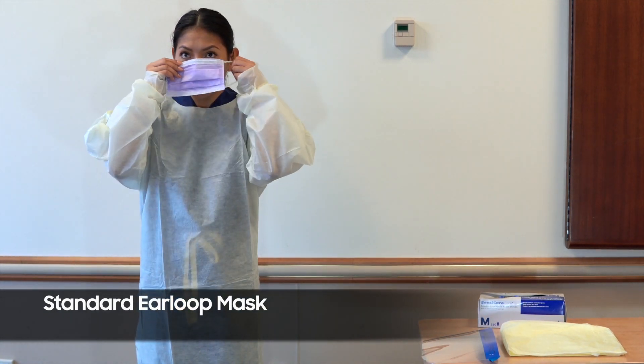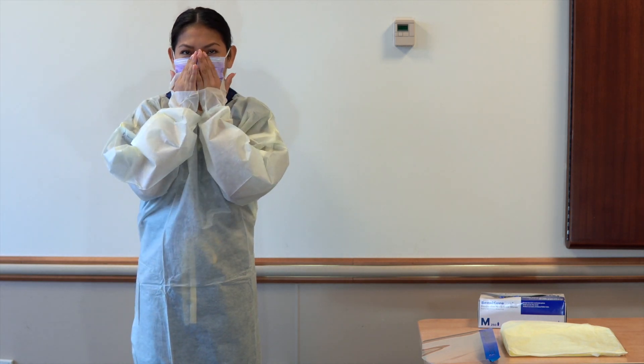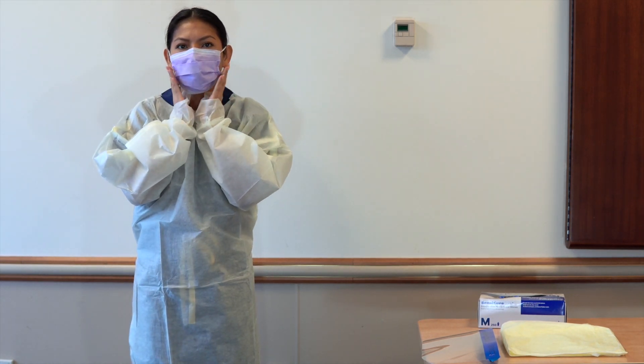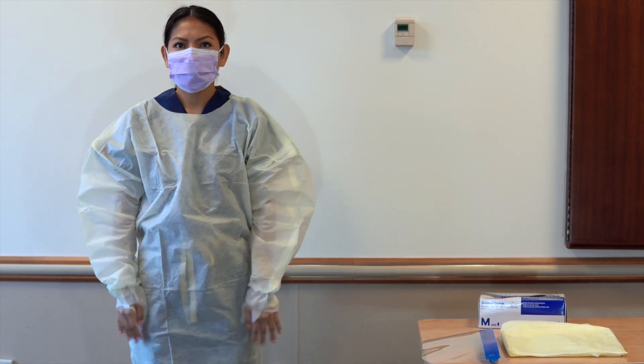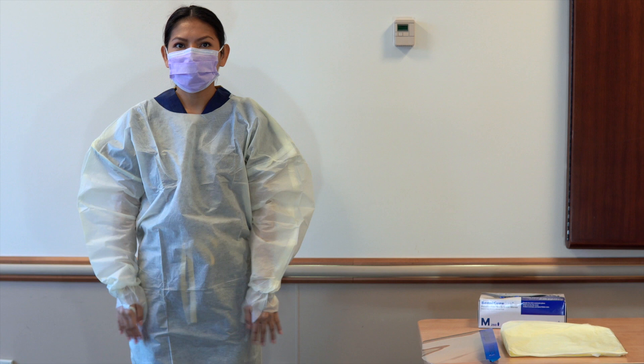Don standard ear loop or surgical mask with face shield. Ensure flexible band is fitted to nose. Ensure mask fits snug to face and below chin. Ensure that hair is properly secured and away from the face.